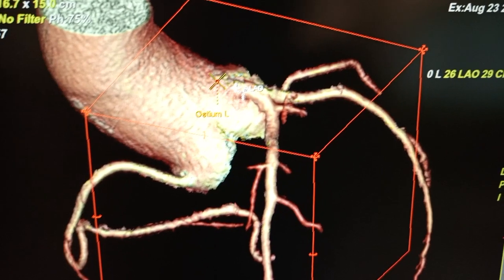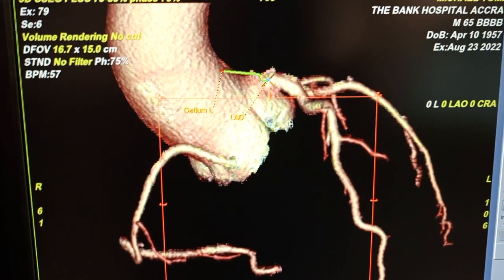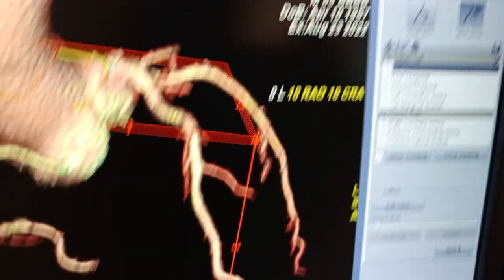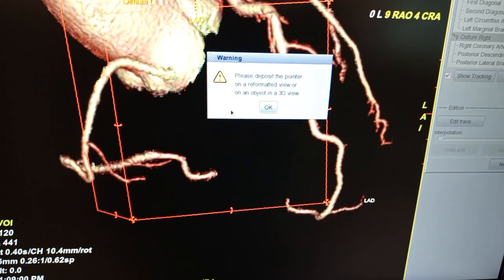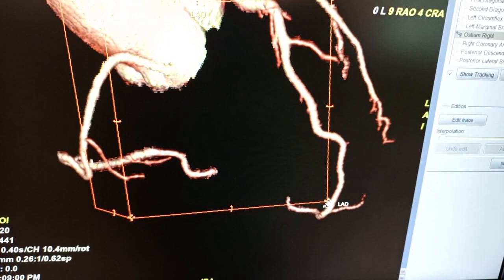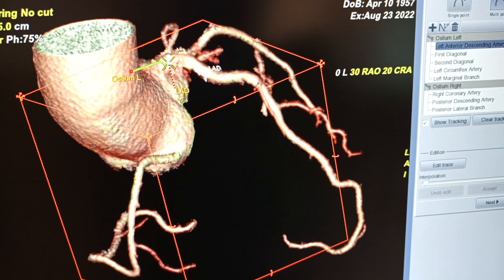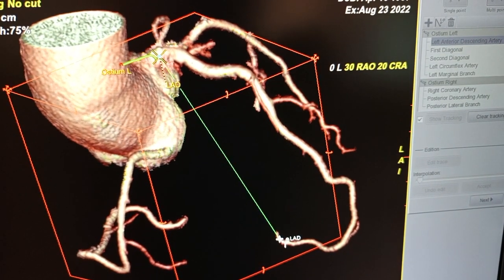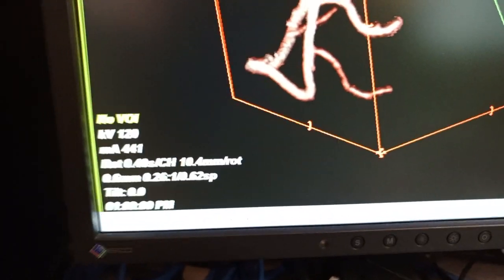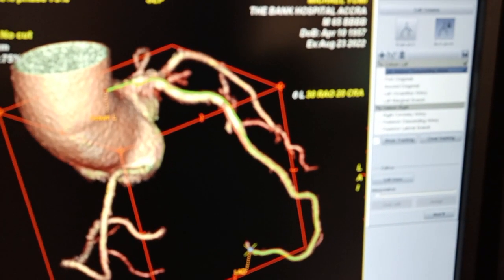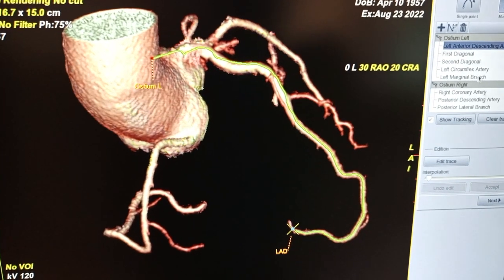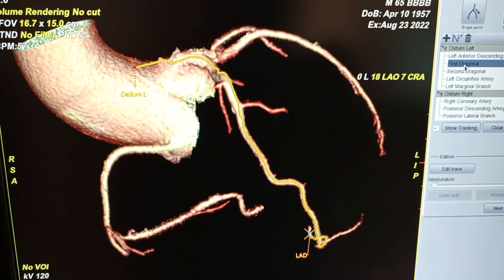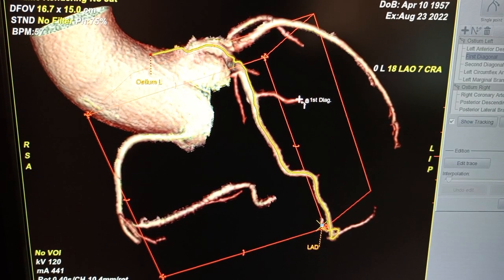We take it from here to here. It's performing the vessel tracking. Let's click on the left anterior descending — this is the LAD. It goes all the way from here, tracking down to this area. It's performing the vessel tracking and it's done. Now I need to add a diagonal — this could be the first diagonal. There is the first diagonal.